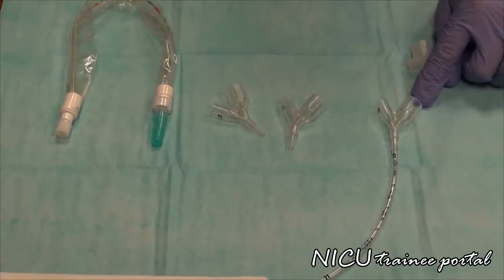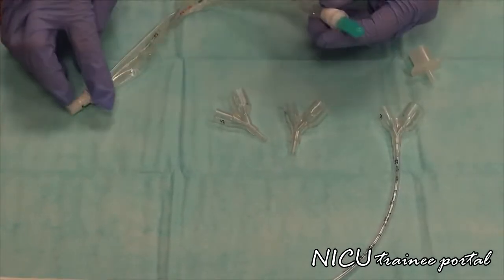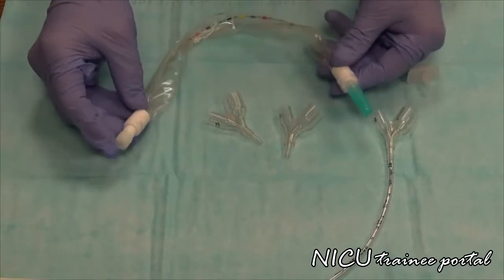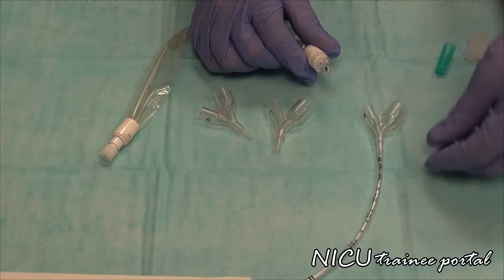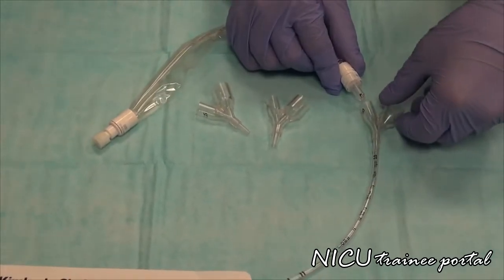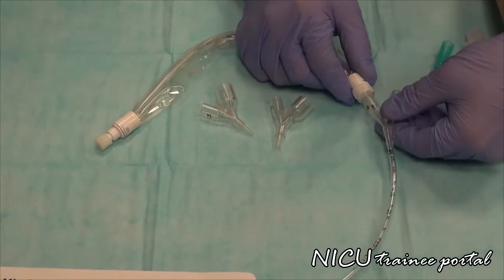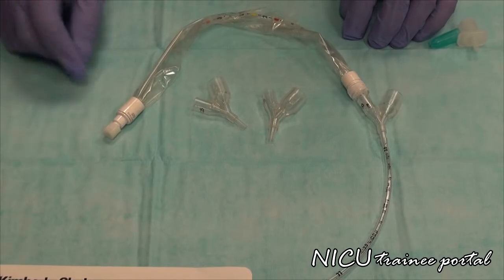So from here, we take our 5 French catheter, we remove the blue cap, and this catheter goes in the smaller of the 2 ports, which goes like that. And now you are ready to administer your surfactant.